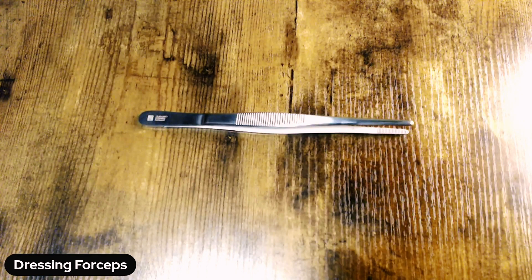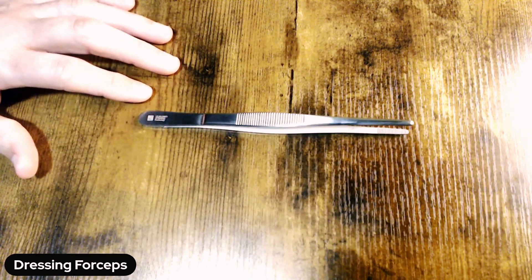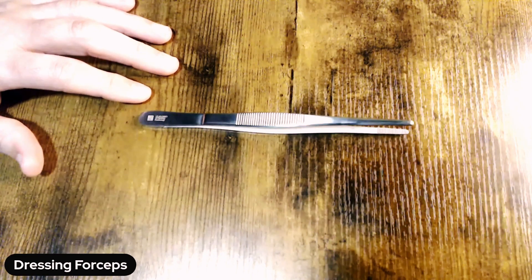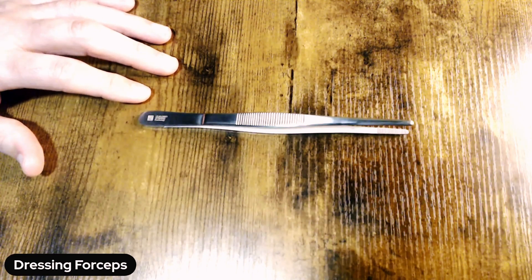Hello, my name is Dressing Forcep. The device that we have in front of us today is a six and a quarter inch dressing forcep.